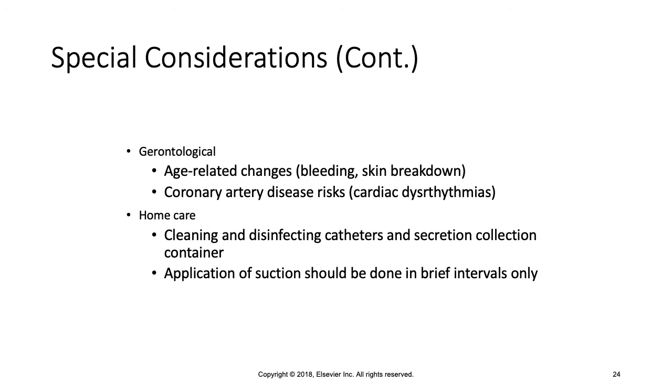If a patient is at home, they need to be taught how to clean and disinfect the catheters that they're using for suctioning and how to clean the secretion collection container. They'll need to be taught that suction should only be applied for brief intervals, no more than 10 to 15 seconds, with 1 minute rest periods in between. Replace the supplemental oxygen and allow the patient to recover.